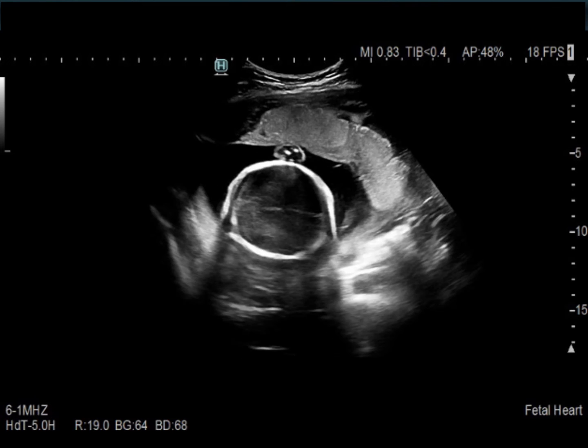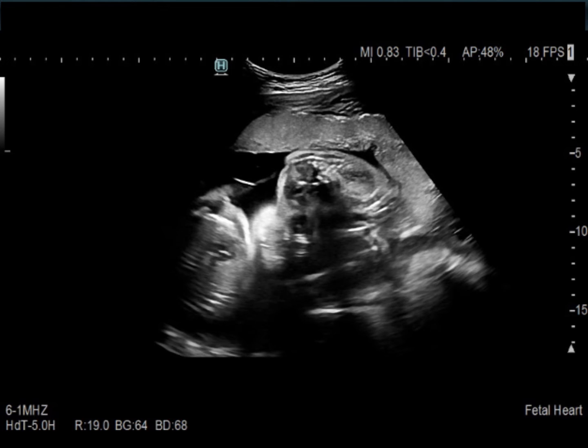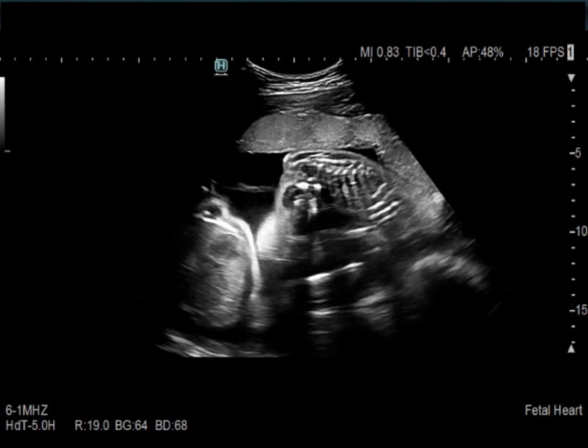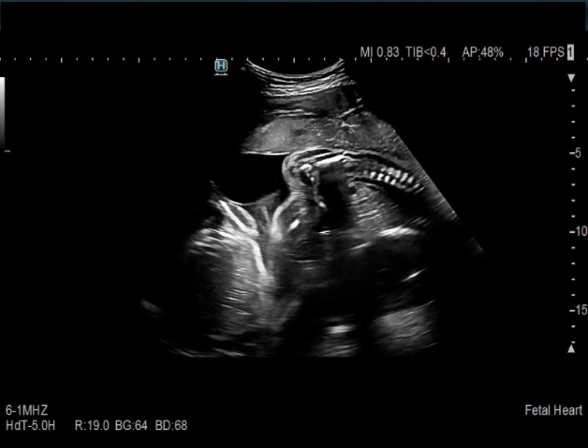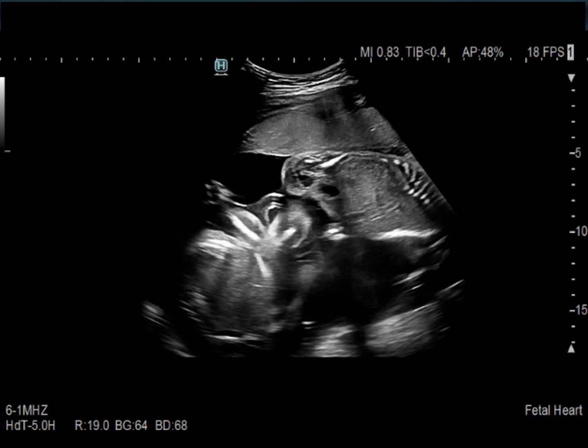And as we come to fetus A, you see the head of fetus A. We see the body going off to the maternal right. We start to immediately see another fetus show up, and that's the rump of the fetus. So that's the bottom of the fetus. That would be more of a breech oblique. Since we're scanning in a transverse format doing our fundal sweep, we see the bottom backside of the fetus here, the pelvic region, here's the bladder, the spine goes this way, and so this is mostly transverse for that fetus.